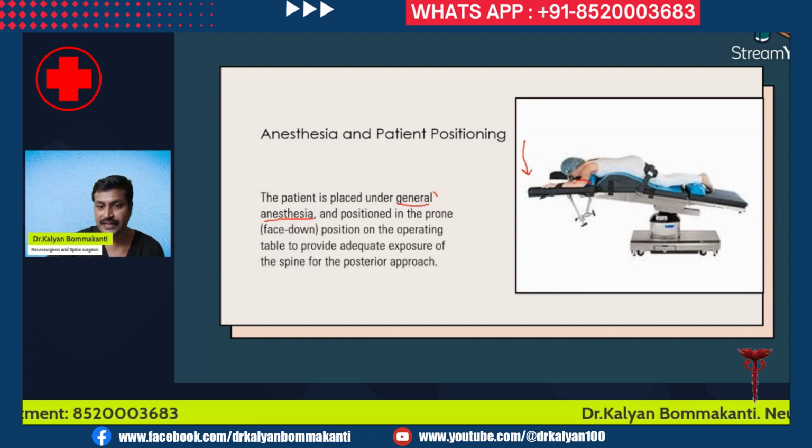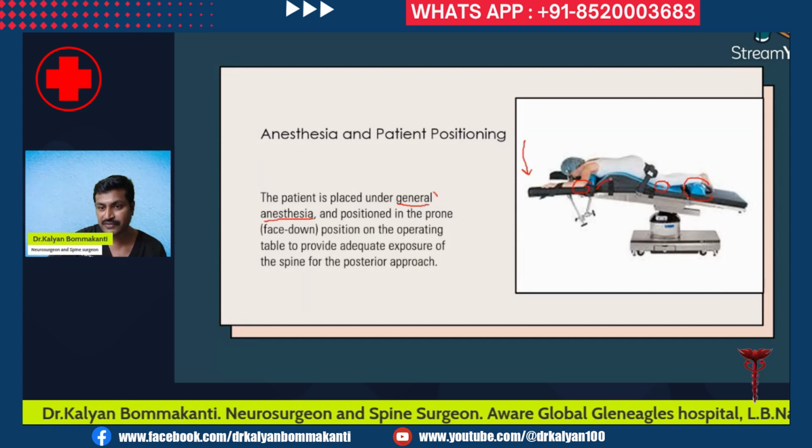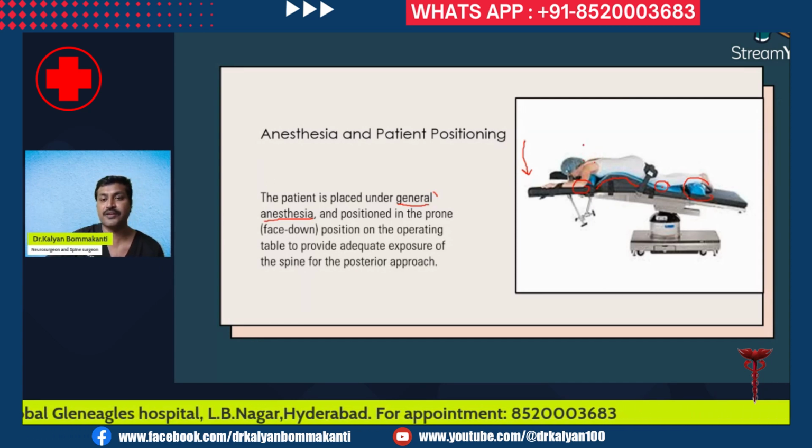Ensure that all the pressure points are properly padded. You can see the knee, you can see the heel. We have padded all the pressure points. The abdomen is well supported. The abdomen is free because of the frame. Ensure that the neck is properly positioned above the heart level, and there should be no compression on the neck.